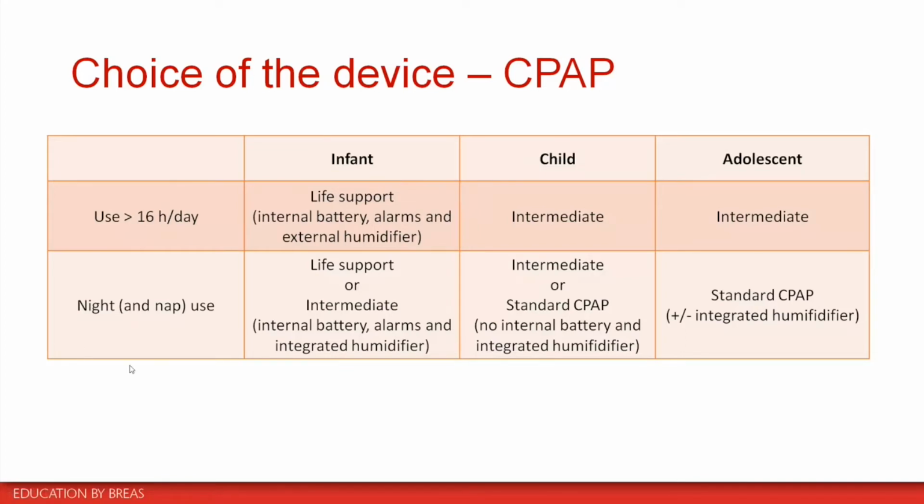If the CPAP is used only during night and or naps, you can either choose a life support ventilator if you feel very comfortable with this, or if you have the experience, try with the intermediate device. Once again, you will have internal battery, but of lower duration. You will have some alarms that are different, but you will have integrated humidifier.